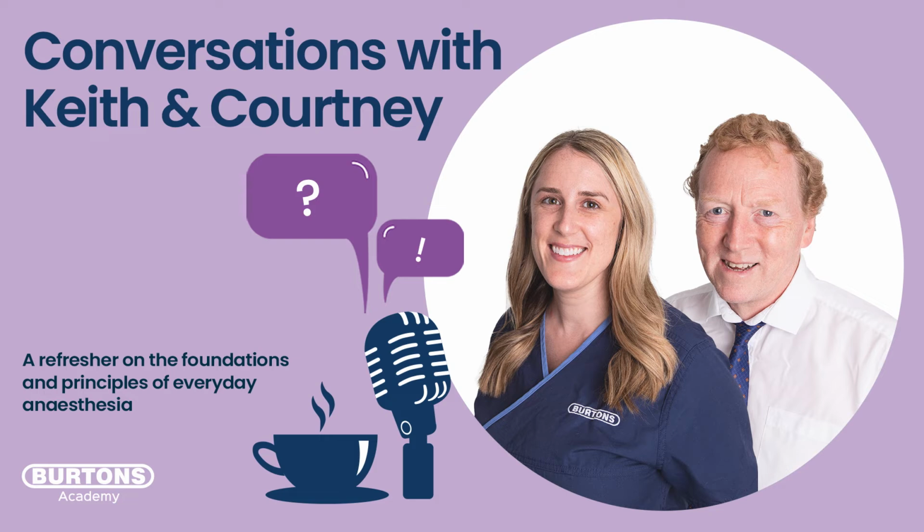As they start to breathe in, that dead space, which retains the remains of the CO2 that's just been breathed out, gets pulled back in very quickly, replaced by the fresh gas that's coming in. So you see a very rapid return to 0. Your starting point for phase 0 is the end tidal point, and you see a very quick drop, and it should go to 0. If it doesn't go to 0, there are some reasons why, and we can discuss that here or maybe another time.